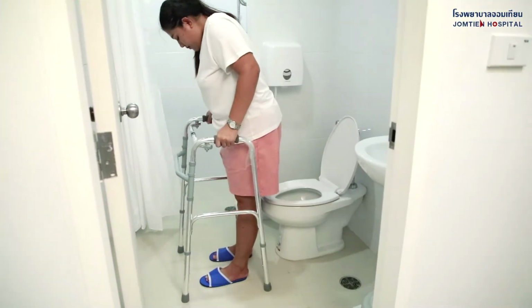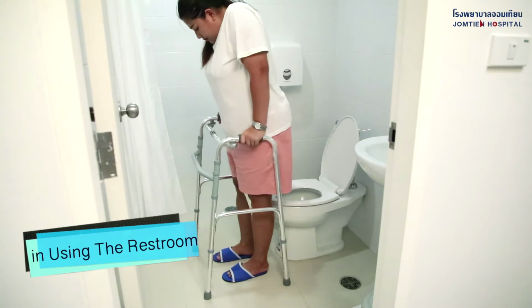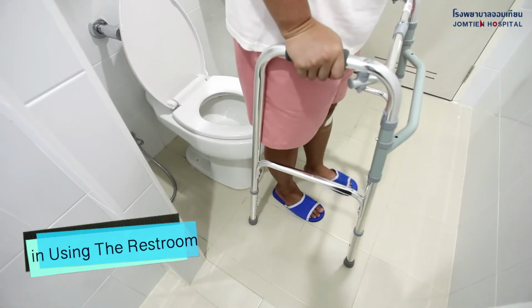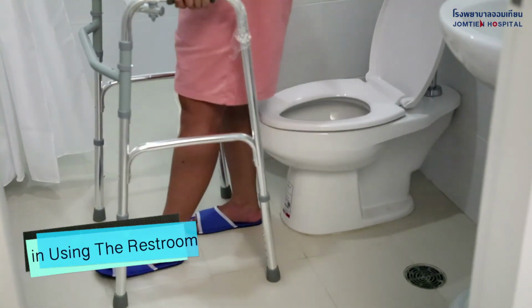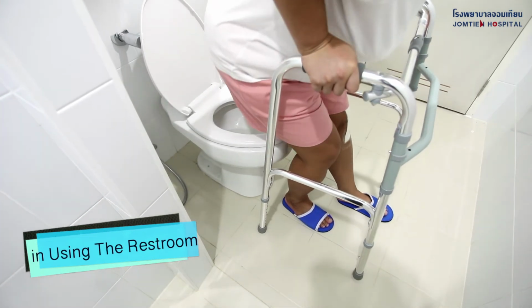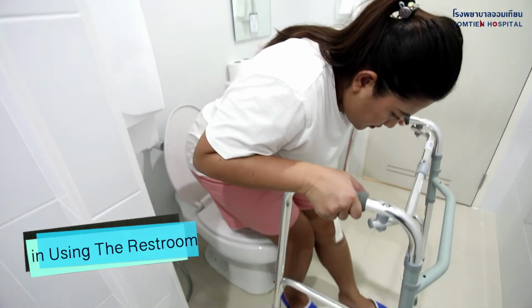In using the restroom. In sitting on the toilet seat, step backward with the non-surgical leg first and follow with the surgical leg until both legs touch the toilet. Then raise the surgical leg forward and reduce the weight on the surgical side while gradually sitting down.